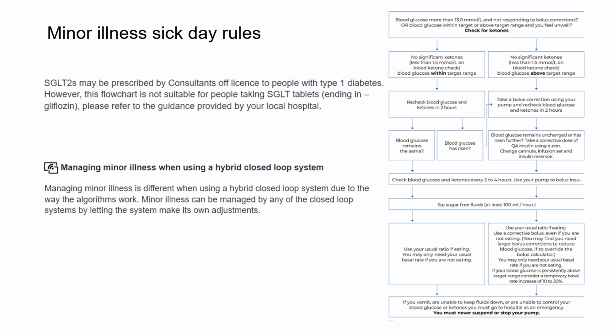Although SGLT2s are off licence in type 1 diabetes, some participants may have them prescribed by their consultant. If participants are taking SGLT tablets, they are advised to follow guidance provided locally. Hybrid closed-loop users are encouraged to let the system make its own adjustments for minor illness.